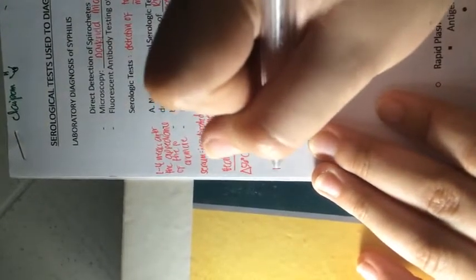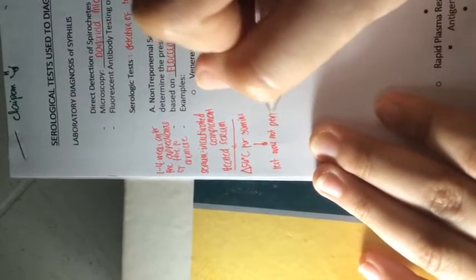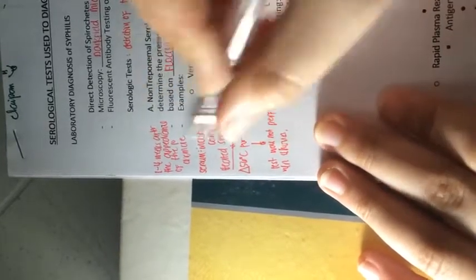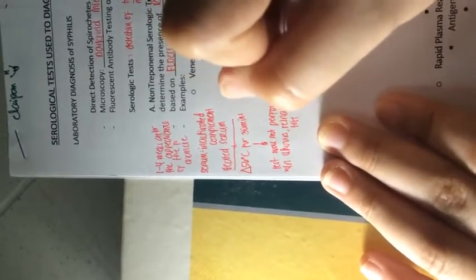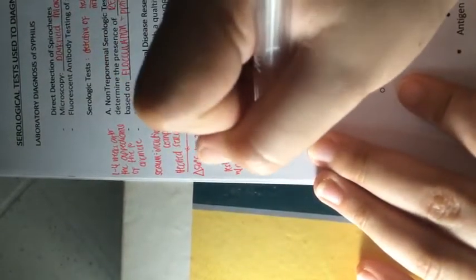Now, if the test was not performed within 4 hours, then we need to inactivate the complement again. So we need to perform reinactivation. How do we do that?